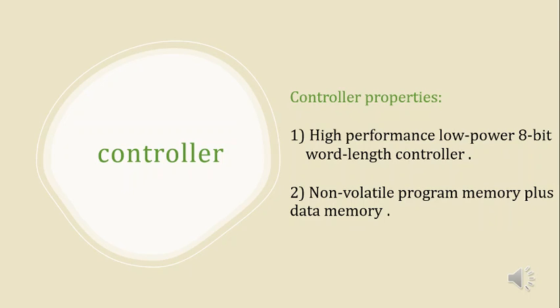Controller. The controller has some properties. First property: high performance with low power, 8-bit word length controller. And the second property: non-volatile program memory plus data memory.